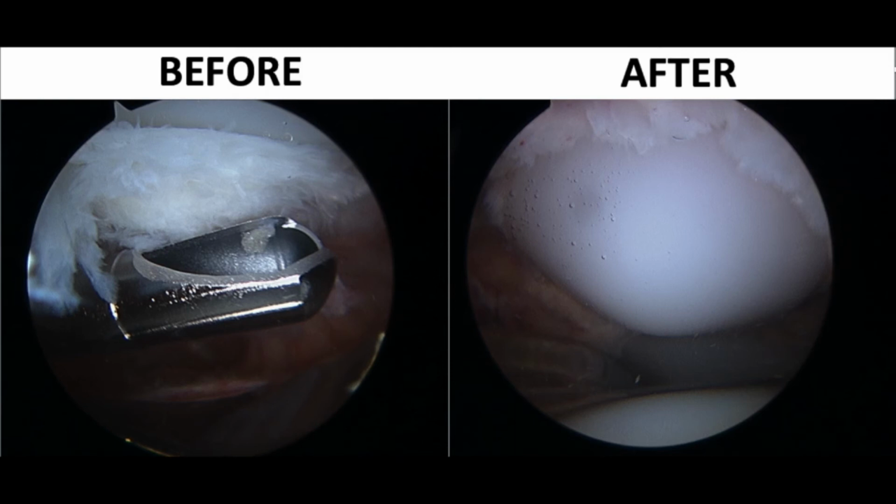So the summary is that an arthroscopy is a pretty powerful tool to use for either treatment or diagnostic purposes when people have a painful knee or partial knee replacement.